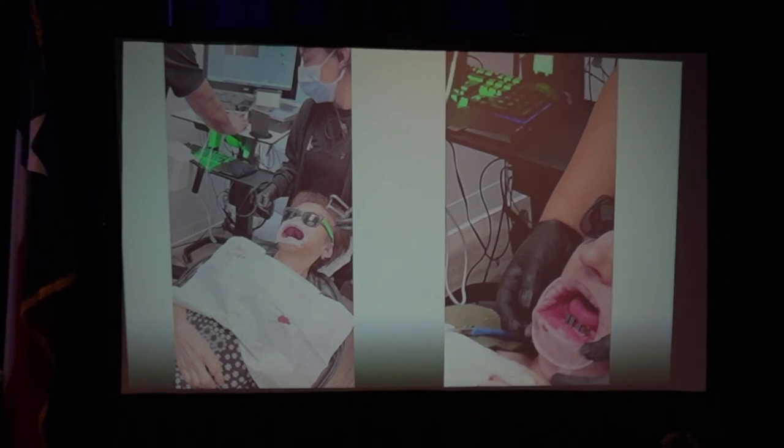It is, because I send the patients home. You can do same day if you want. Just the patient's sedated. So one of the people debate is like, oh, the patients are expecting their teeth. I don't have anybody push back. I said, well, get done with the surgery. You're sedated. You've got to come back either way the next day to adjust your bite. So we'll just go ahead and let you rest, and then we'll bring you back the next day. First thing in the morning, they come in, screw in the teeth. That's it.